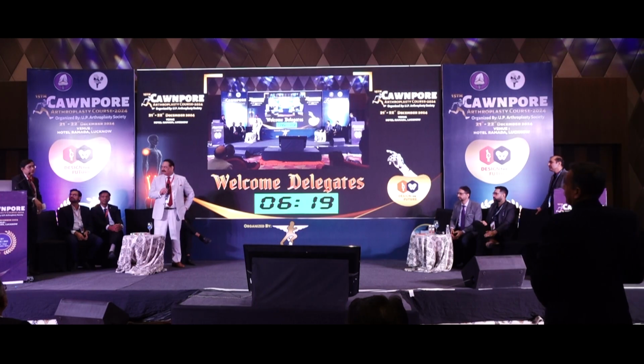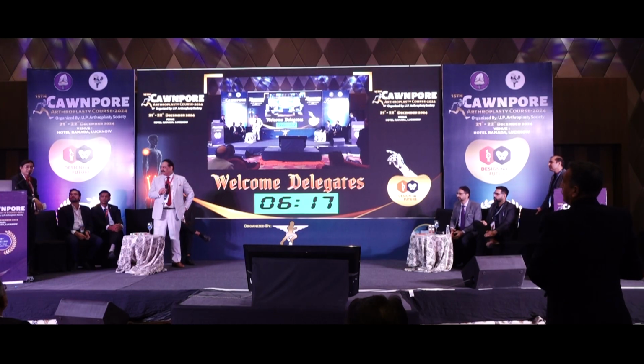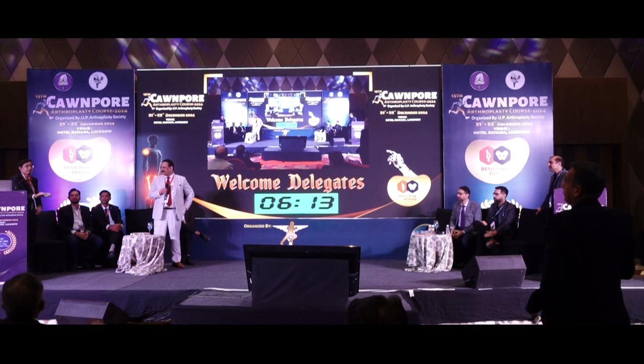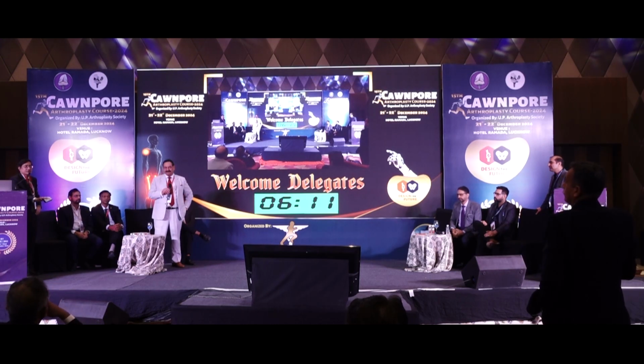I can tell you, every OPD I see 1 or 2 patients. You should be very clear. Should not do bipolars in younger people. Never. They are going to fail in 4 years, 5 years, 6 years, 7 years.